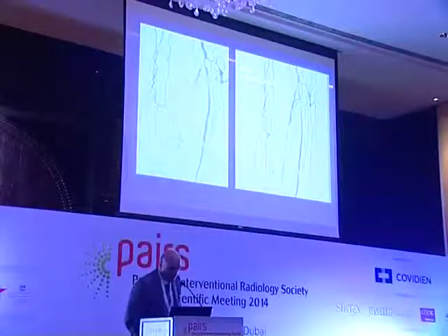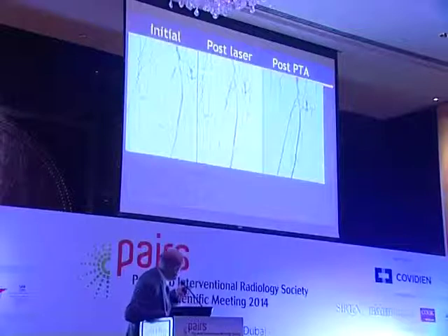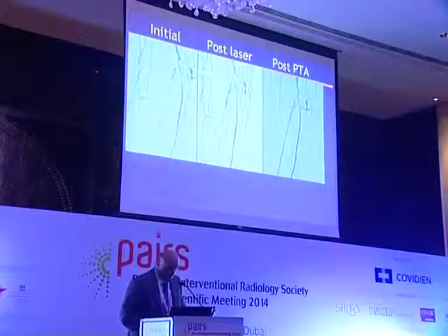Usually it doesn't look really pretty after laser. It looks much better after angioplasty. And again, the whole idea is that with your angioplasty, you do this long inflation at a low inflation rate, with less risk of dissection, and usually you have better results with that.